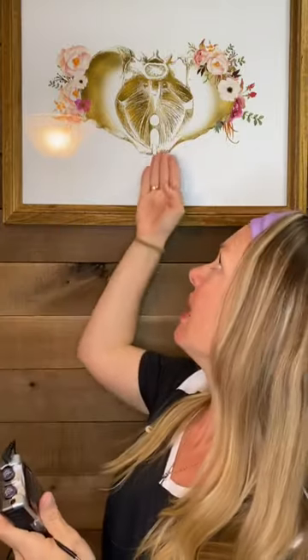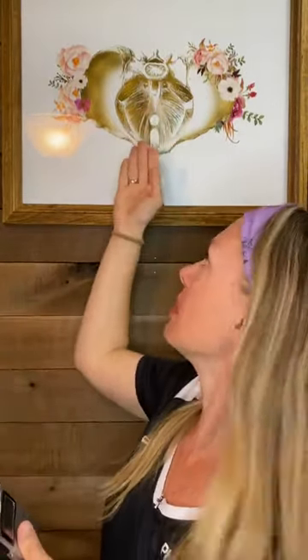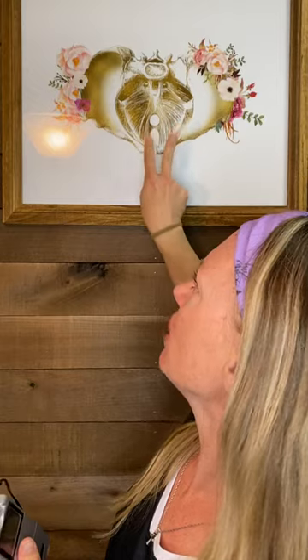So the setting that I like to set this at, you'd place these electrodes on, you'd connect them, do the rubbing alcohol, put this on that space at 3 o'clock and 9 o'clock of your bottom, really close to your bottom, because if you put it too far away, then you're on your glutes and your butt will tighten up and not your pelvic floor muscles. And we are trying to strengthen these innermost muscles. So right there. And you don't want to put it here because you've got other very sensitive tissues right there. So there's not so sensitive tissues on either side of your anus.